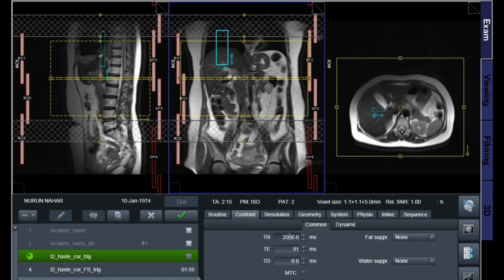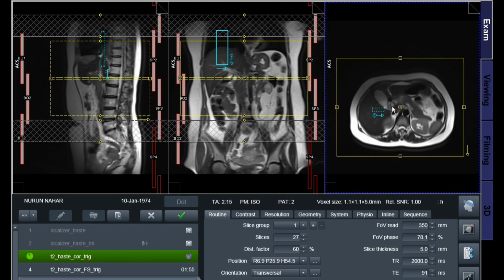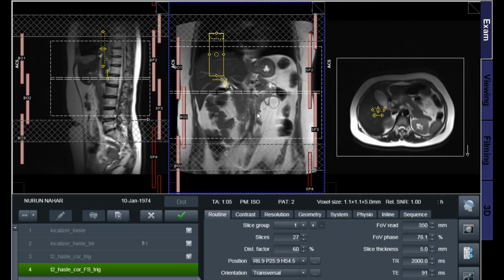Indications of MRI HBS. MRI HBS is indicated in chronic liver disease, cirrhosis, hepatocellular carcinoma, HCC, liver metastases, biliary obstruction, choledocholithiasis, cholangitis, gallbladder carcinoma, congenital biliary anomalies, pancreatobiliary tumors.